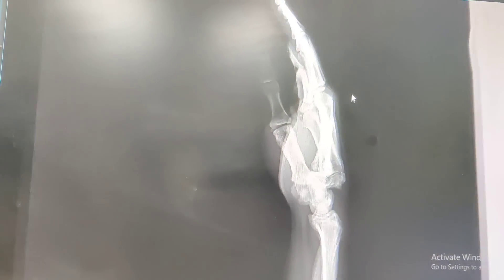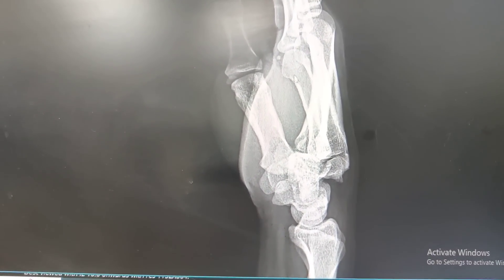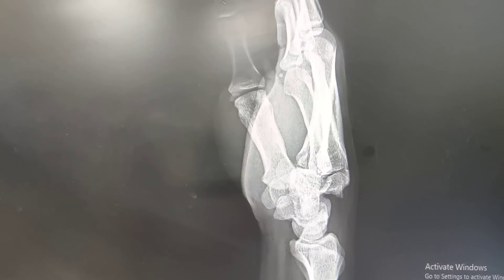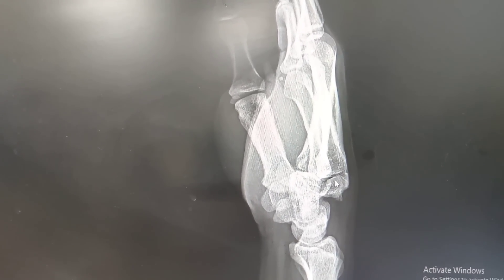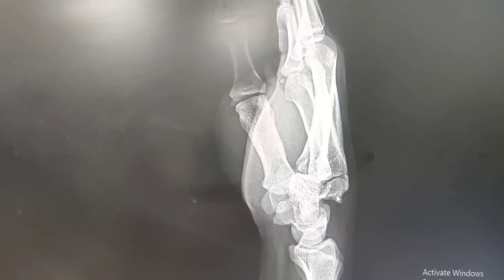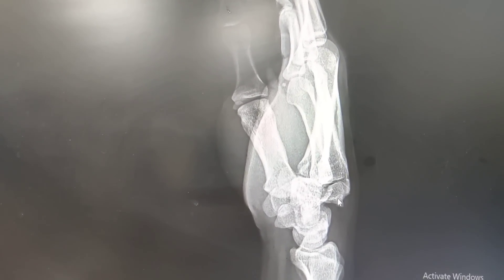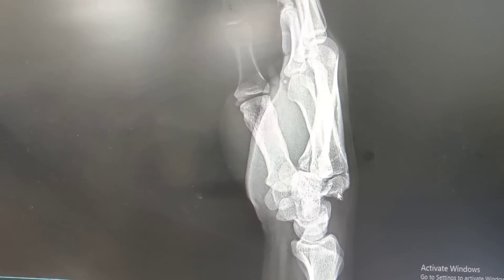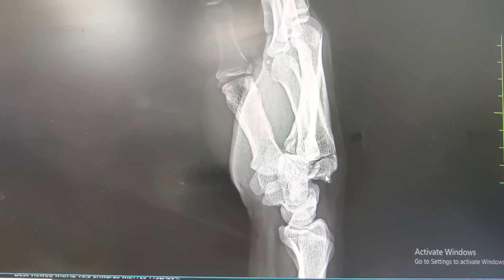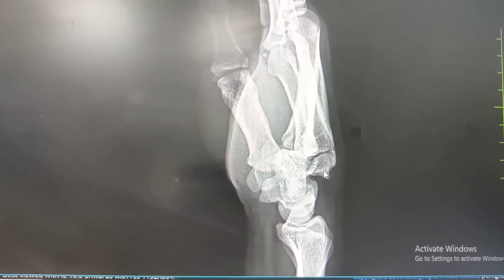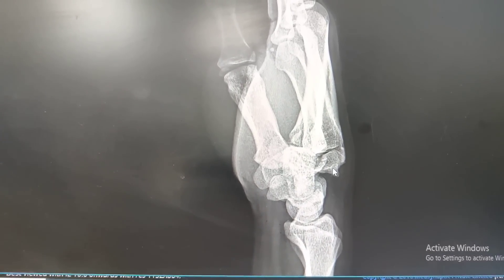We then got a true lateral X-ray done, and if you look at it you can clearly see that these metacarpals are flexed. There is also a piece of carpal bone which has avulsed. The true lateral view confirmed our clinical suspicion of carpometacarpal dislocation — this is in fact a fracture dislocation. So this patient requires reduction and K-wire fixation, and that is what we are going to do today.